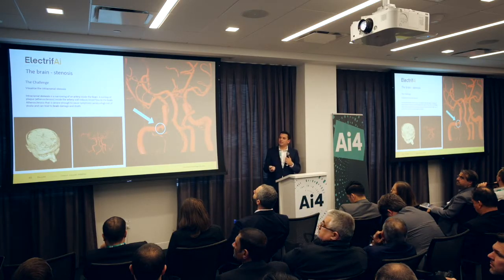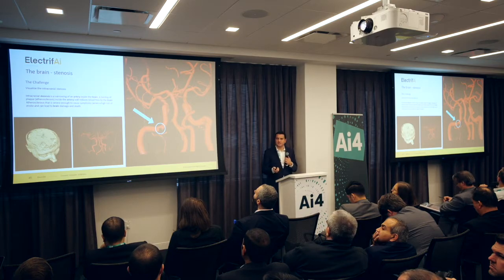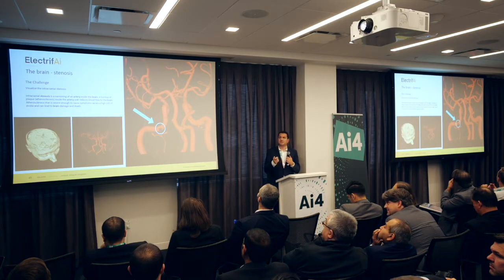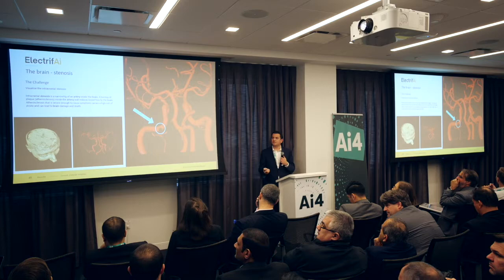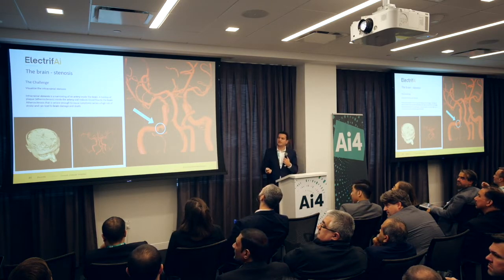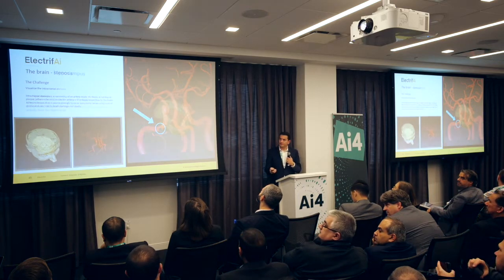But it is possible that by starting with this, removing all irrelevant data, and irrelevant data in this case means 2 things: whatever is not as elongated as the vessels, and whatever is not as big as the vessels themselves. So noise, pretty much, and compact features. That leaves you this thing behind, and then you just run a simple profiling that goes along the blood vessel and studies for width anomalies, and that's where you get this alert.